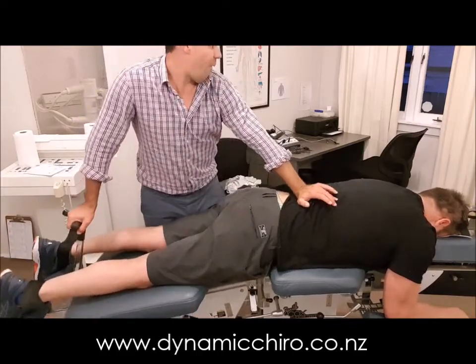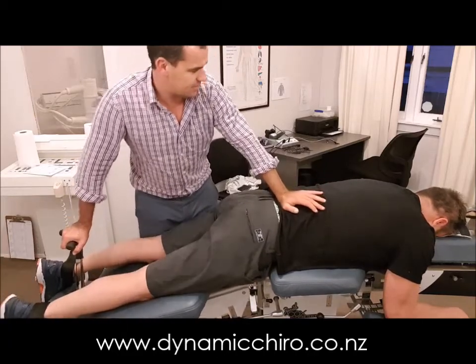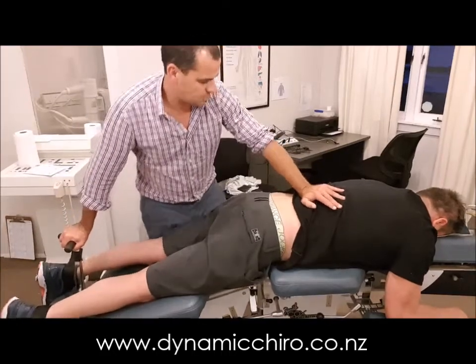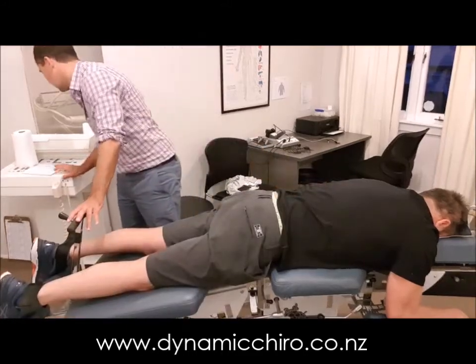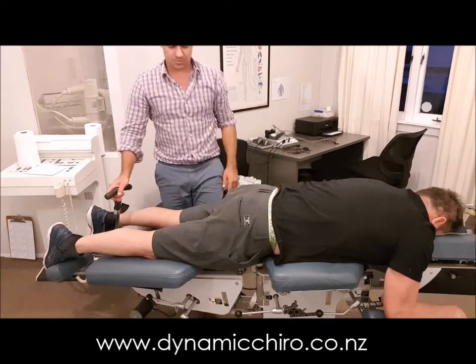We've commenced the treatment and we're going to be just opening up those joints, working up each segment of the lumbar spine. We just keep moving up and down that part of the spine and we're going to work the muscles on both sides. All the while we're checking in with the client — are you okay? Are symptoms getting worse? Is the problem getting worse?